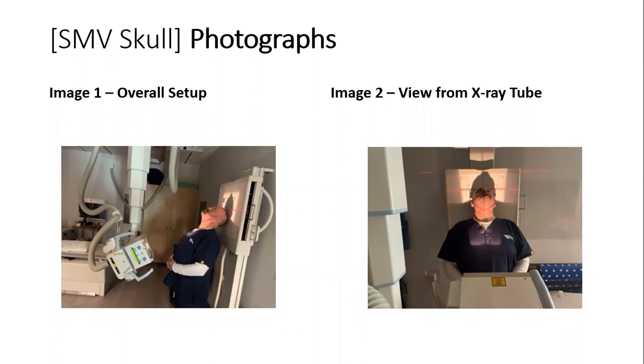On this occasion, the patient was transported to the imaging room via wheelchair by the hospital staff from the emergency room. I greeted the patient upon his arrival and I asked him where the trouble in his body was coming from. He replied that all of the pain was coming from his head and that he was told he was in need of an X-ray.